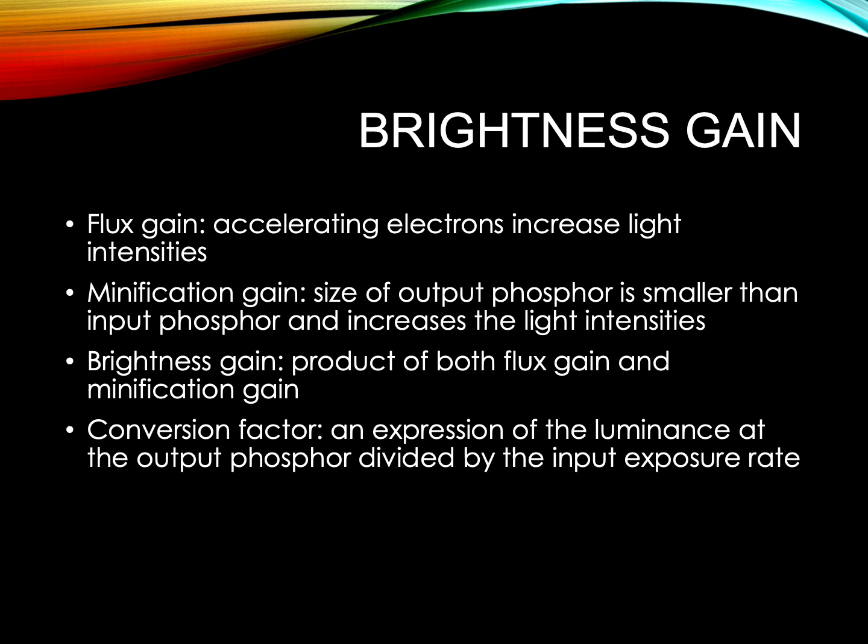Although the term brightness gain continues to be used throughout this chapter, it is now common practice to express the increase in brightness with the term conversion factor. The conversion factor is an expression of the luminance at the output phosphor divided by the input exposure rate.